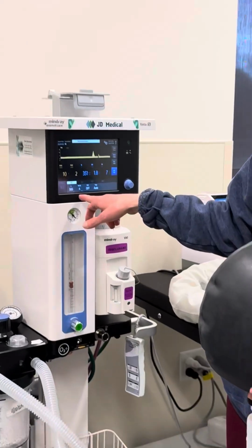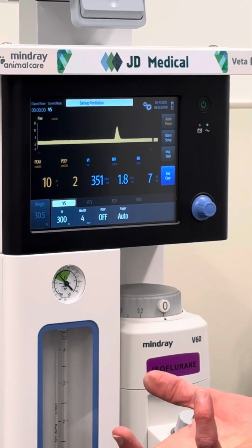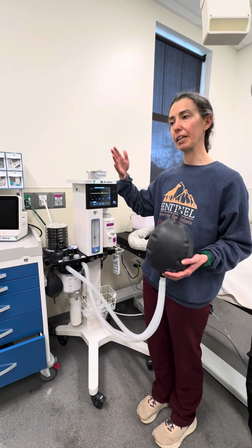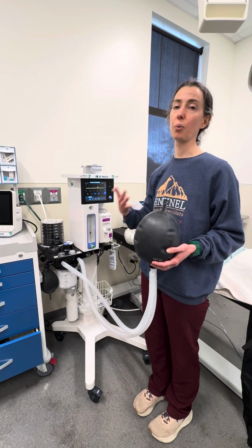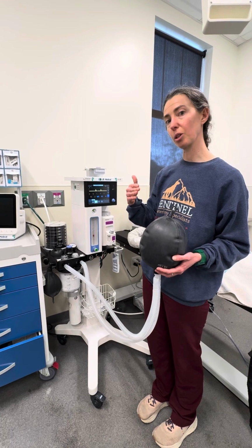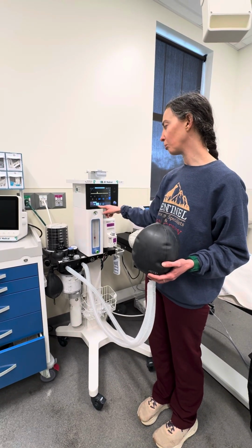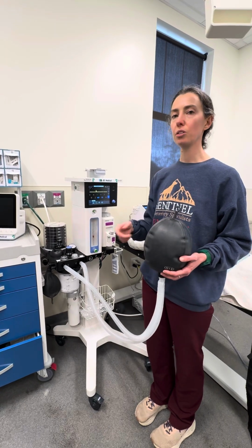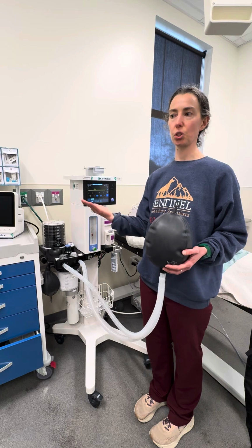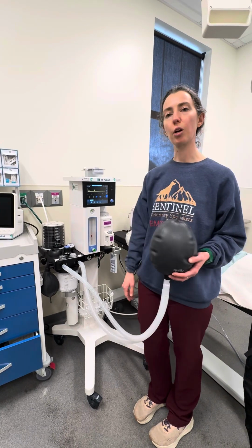So right now we have it set at a minimum of 4 breaths per minute, and that might be okay for some dogs. In other dogs, you'll see your end tidal CO2 start to go up because they're not breathing as much as when they were on the ventilator. So you might find that you still want to keep your end tidal below, say 50. You might still have to increase that minimum respiratory rate a little bit so that you maintain a normal end tidal CO2 as the patient's starting to breathe on their own. So that's basically volume support and volume control ventilation.